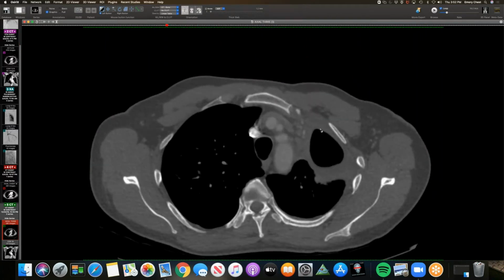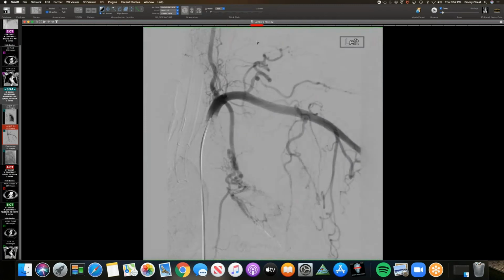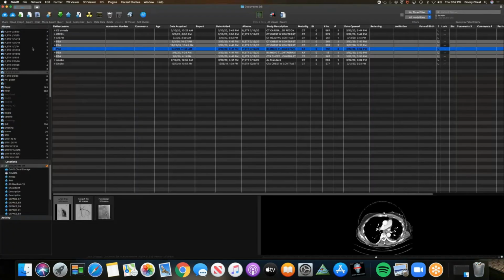Yeah, and I never see. So this was what I was wondering. Have you guys seen all this neovascularity develop? You can see how many vessels are coming down. All these collaterals develop from the systemic circulation going down into the lung, and I'm not sure it's because of the inflammation that's there. That's the only reason I could see for all those vessels getting recruited in there. And then that's it. All right.